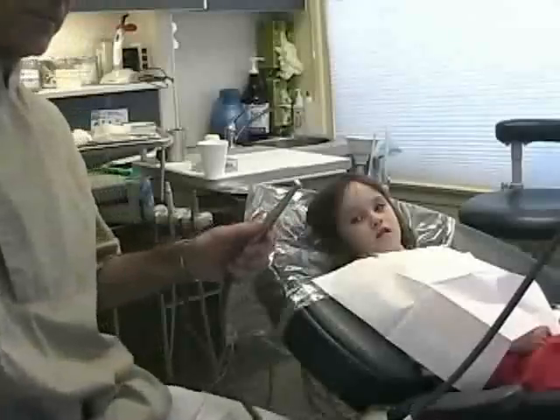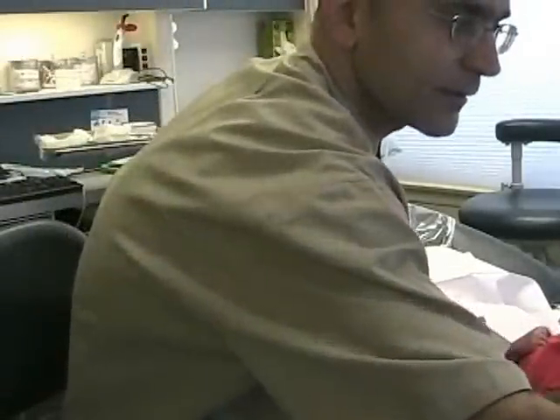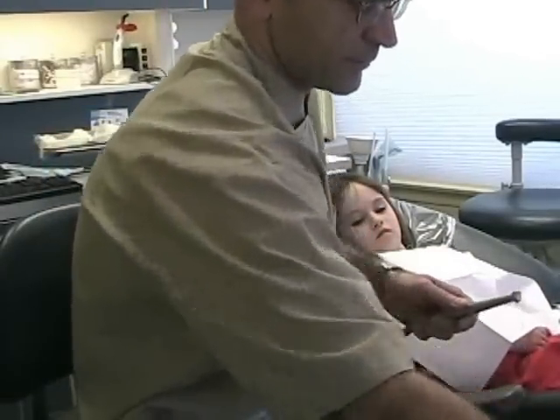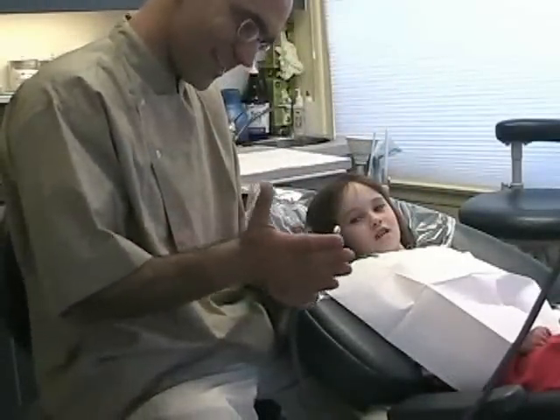Now let's try it first. We're going to try it on my finger first. See all the water?